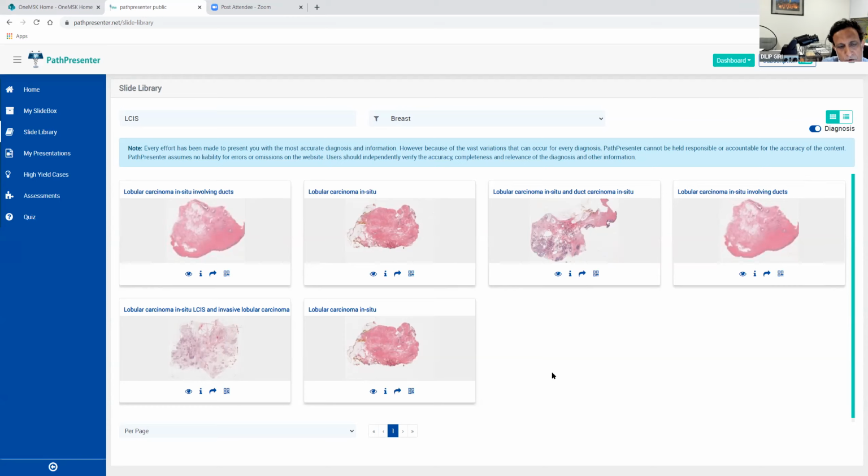Some surgeons will try to clear those margins. And not to forget that even with these foci of pleomorphic LCIS near the margin, beyond the margin there may be subtle invasion, because we know that invasive lobular carcinomas can be multifocal, multicentric, and so on.